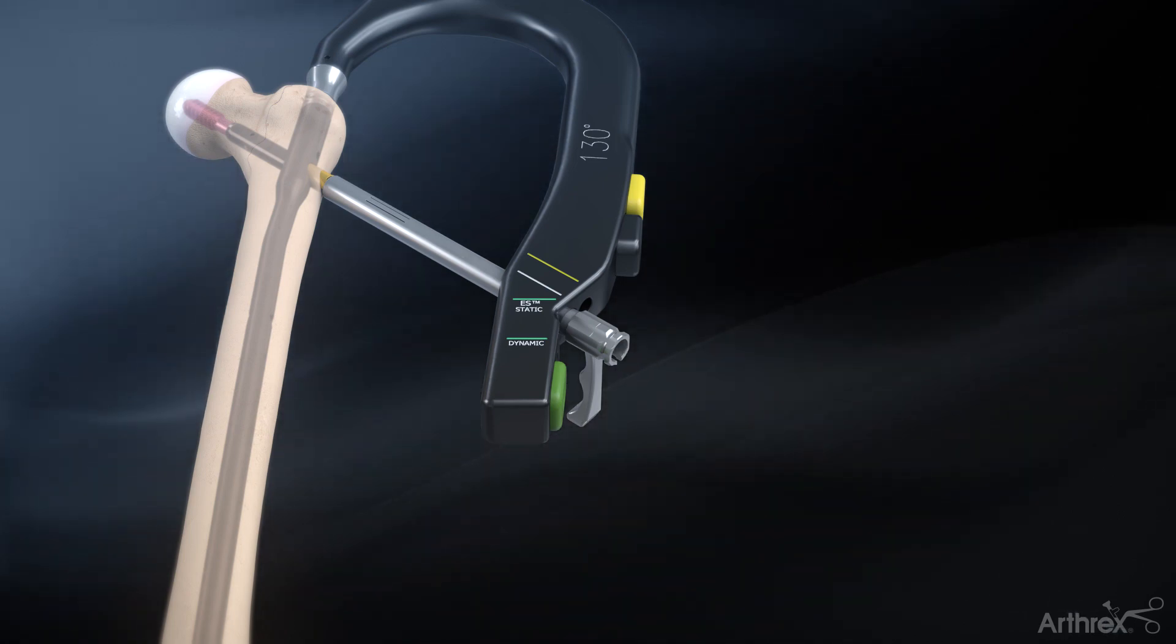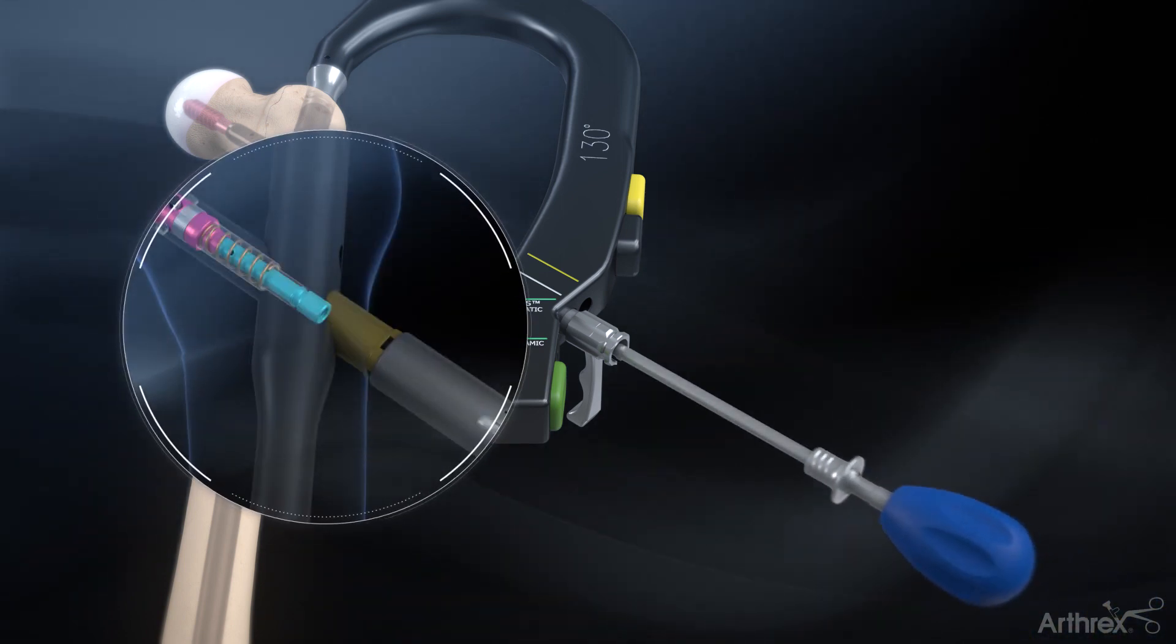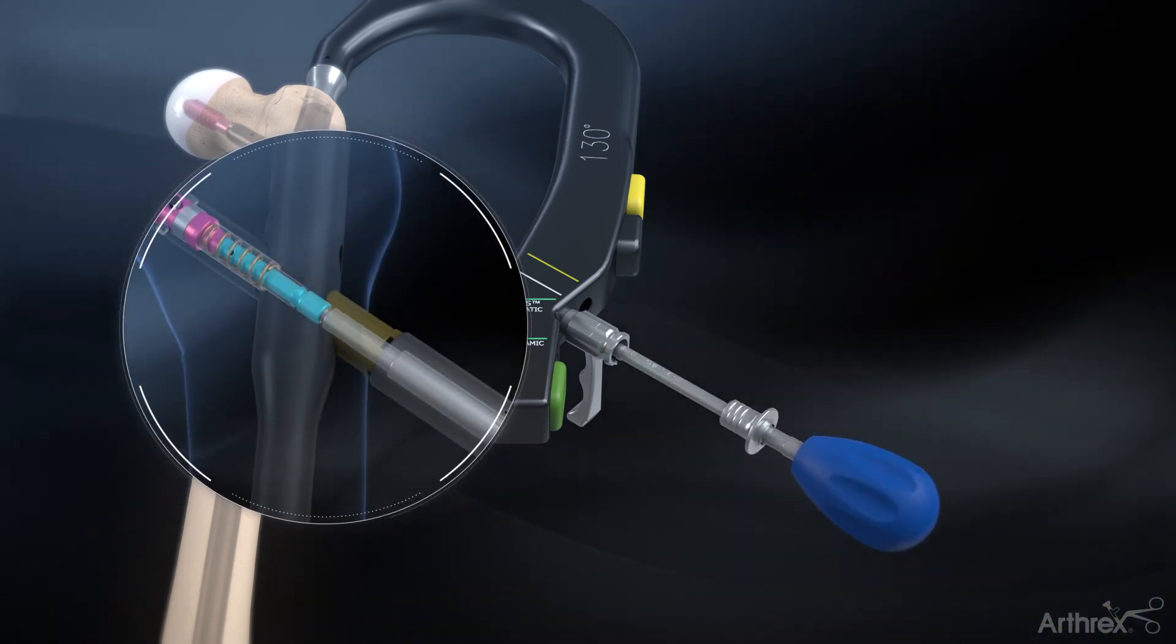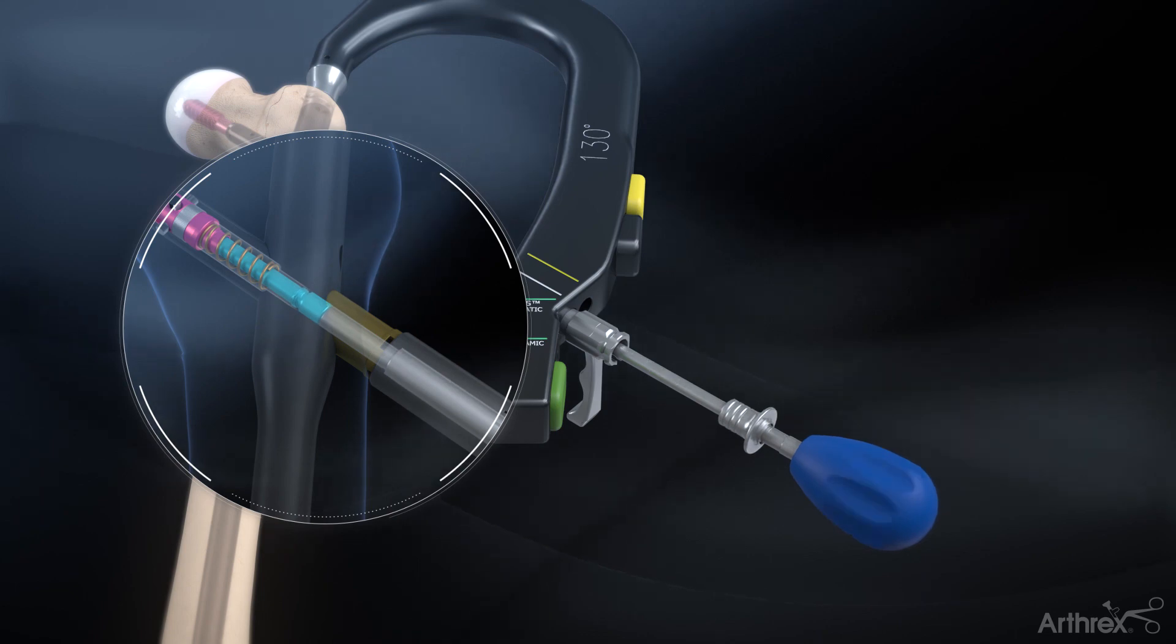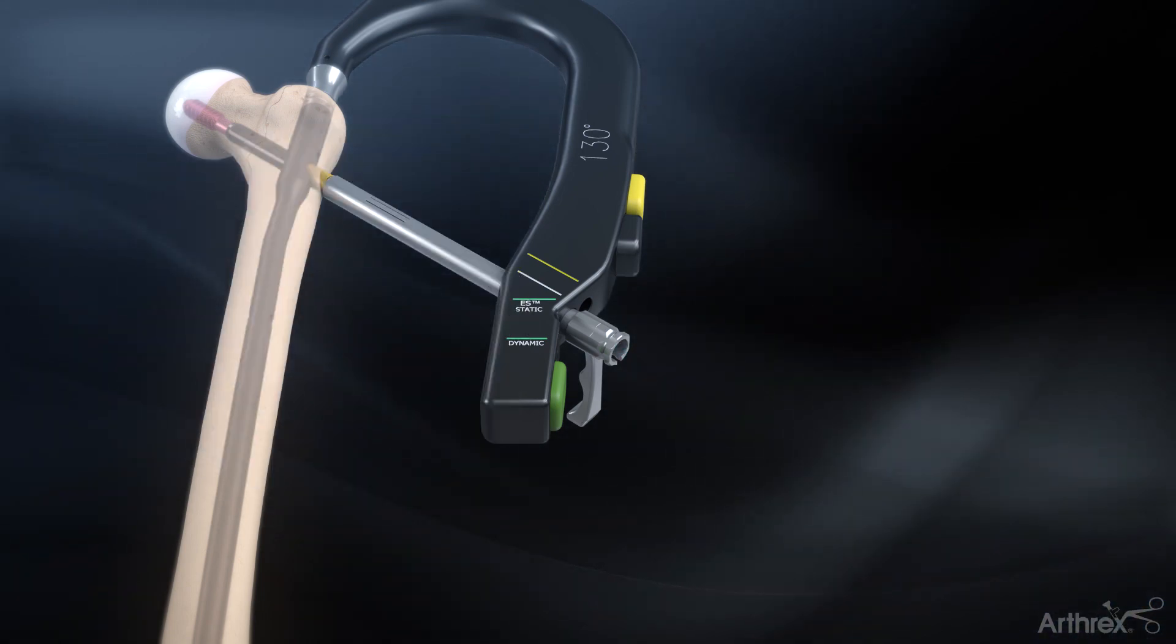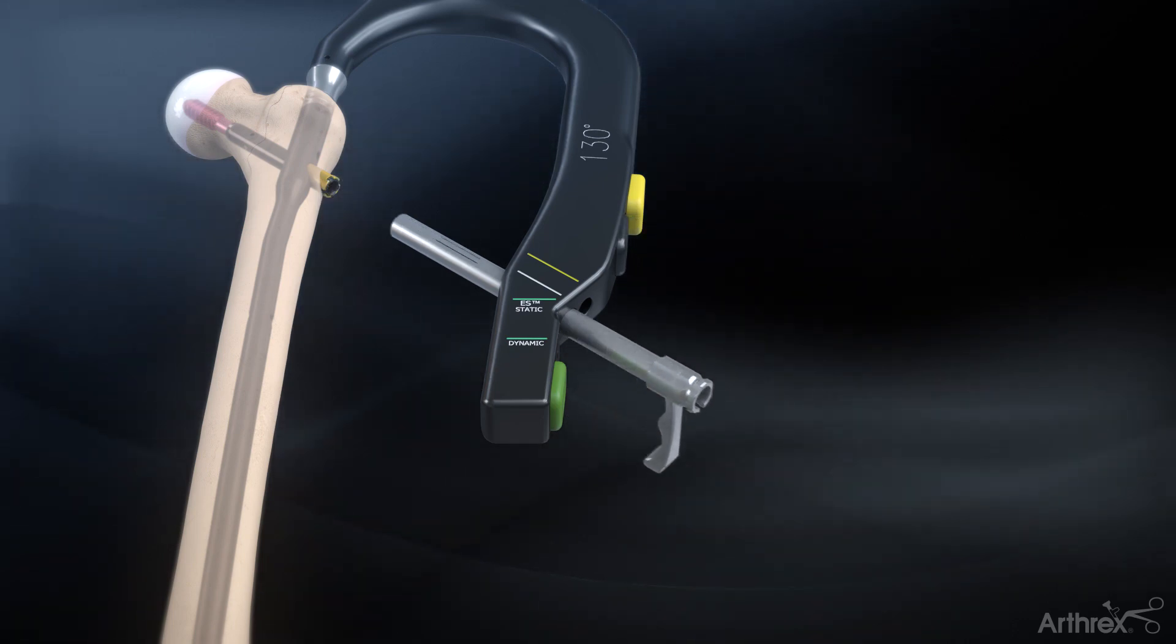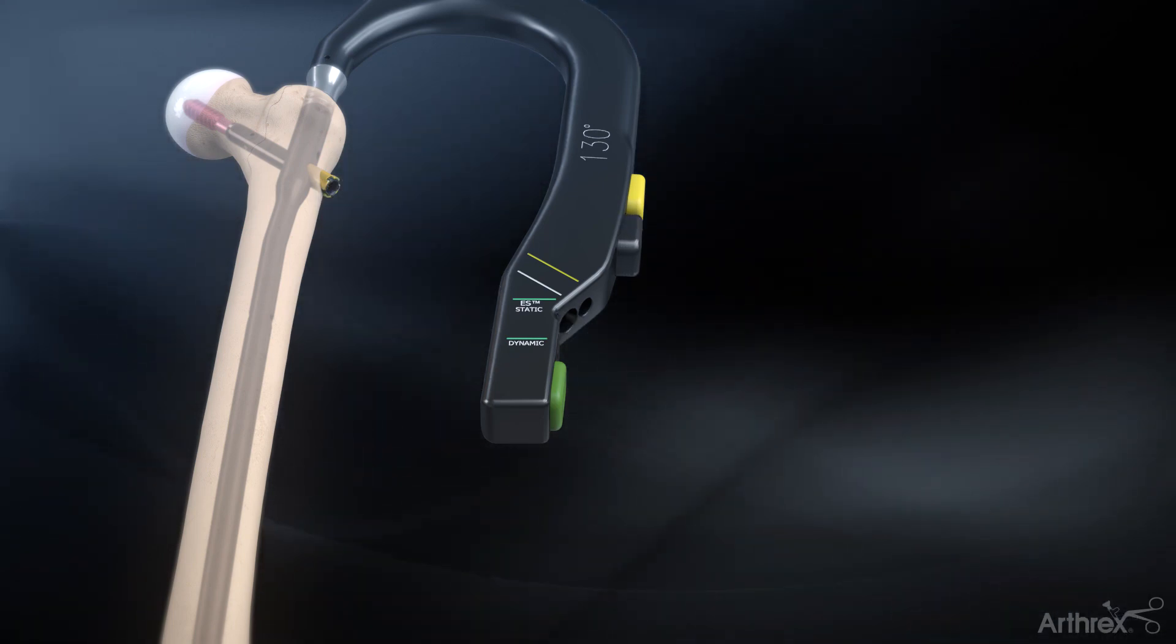To allow post-operative compression in the telescoping lag screw, remove the activation sleeve by inserting the activation tool through the sheath into the lag screw and turning counterclockwise. The activation sleeve will retain the tip of the activation tool once disengaged from the lag screw. Remove the lag screw sheath to complete the lag screw insertion.